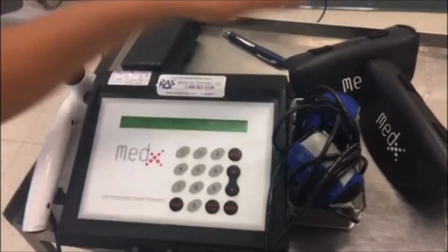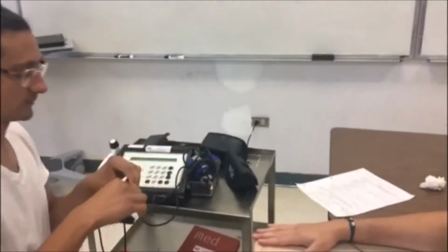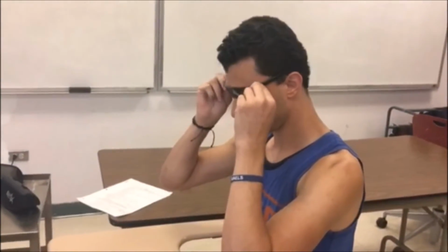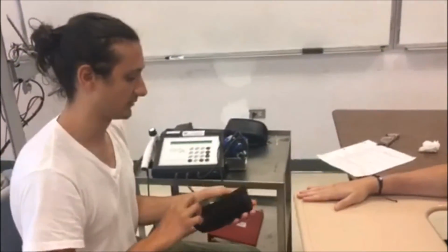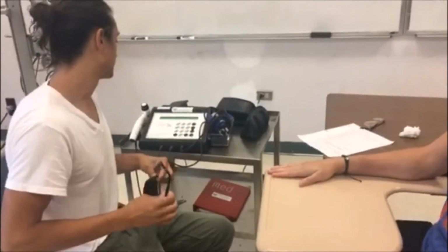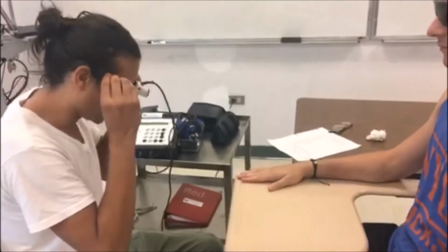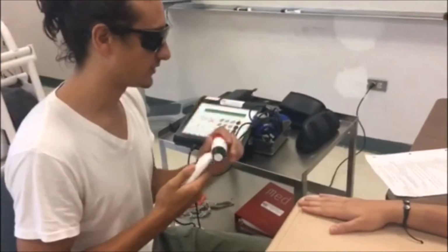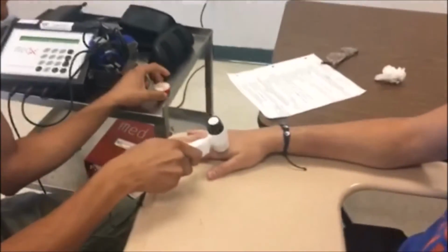Before I press start, I'm going to give Jason these glasses to protect him from the laser. And I will also be using glasses to protect myself. Put these on. Now I'm going to take off the cover, and as soon as you take off the cover, you want to put it right onto that treatment area.